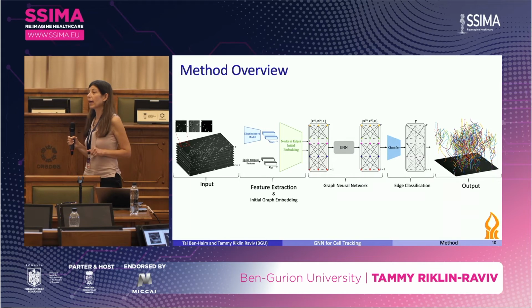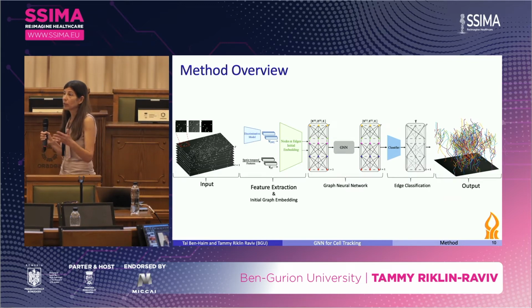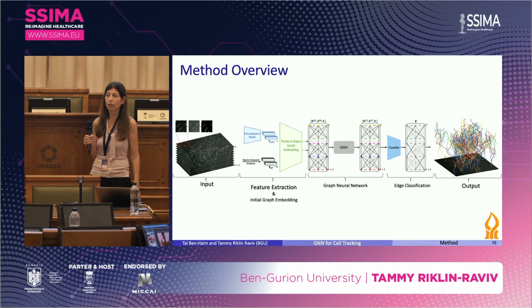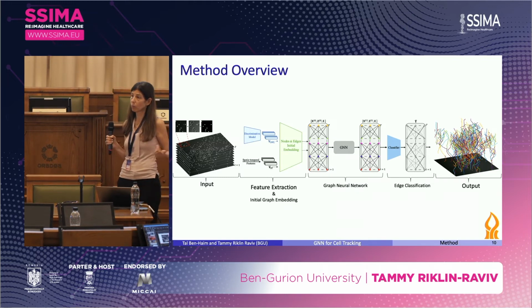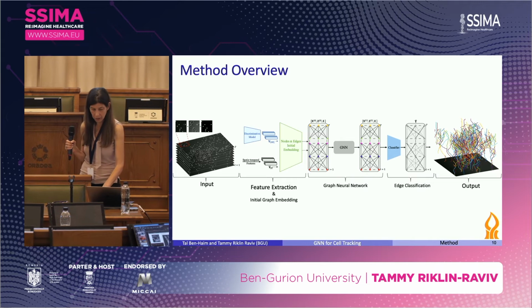So we assume that we have annotation. What we did, we apply a segmentation algorithm. Alternatively, we use an annotation algorithm in one of the cases where we didn't have a ground truth. But it's necessary, otherwise we couldn't. Yeah, it's a good question. So we assume our data is annotated, and we use this annotation in order to provide the tracking. So this is the entire chain.